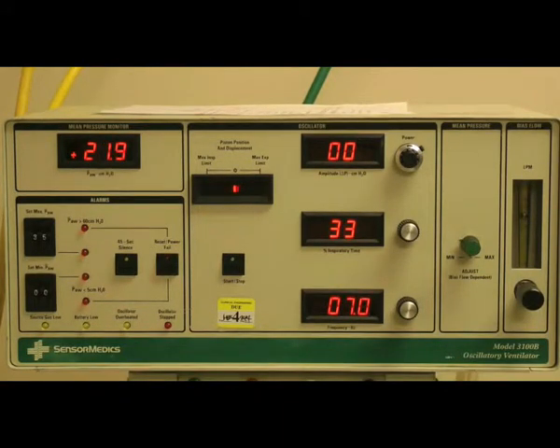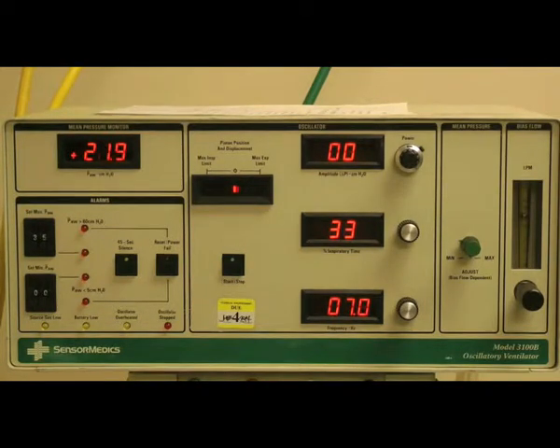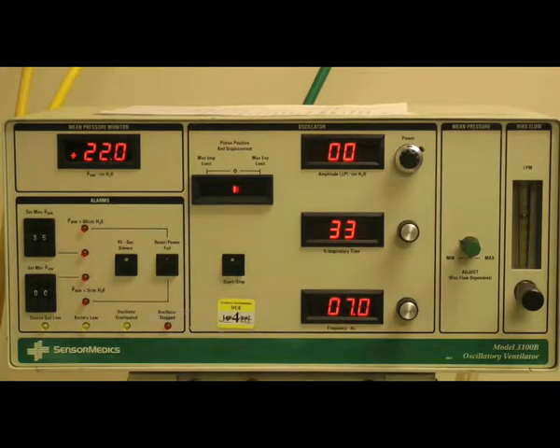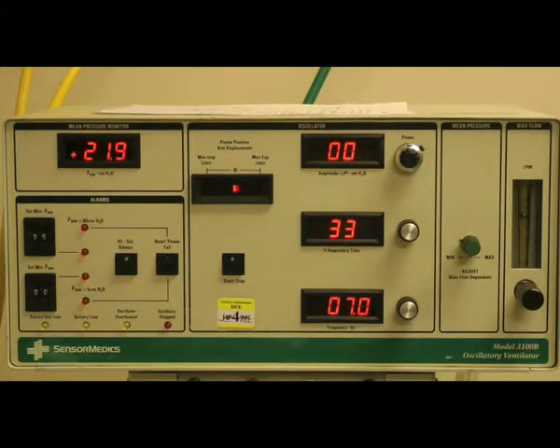However, before you begin, you need to ensure that you have met the indications for high-frequency ventilation. The indications are oxygenation failure, which is defined by an FiO2 of greater than or equal to 0.7, and a positive end expiratory pressure of greater than 14 centimeters of water pressure, or by ventilation failure, which is defined by a pH of less than 7.25 with an initial tidal volume of greater than or equal to 6 mL per kg predicted body weight and a plateau airway pressure of greater than or equal to 30 centimeters of water pressure.